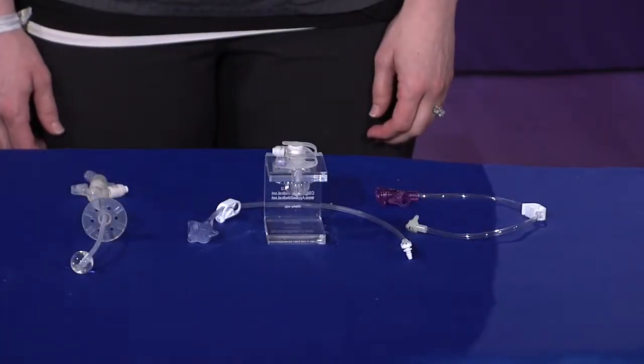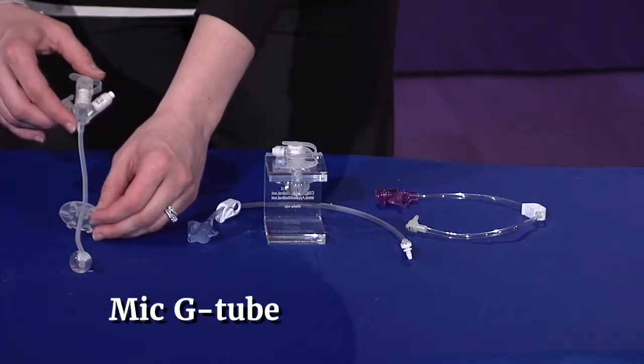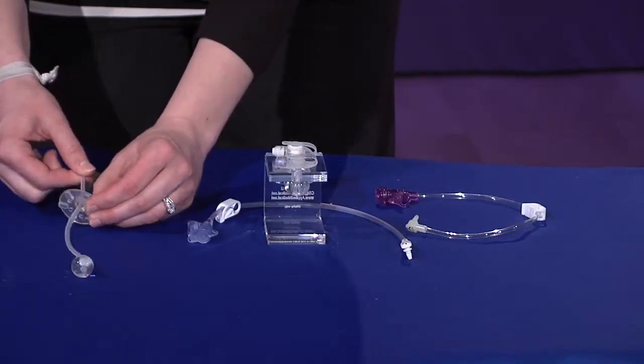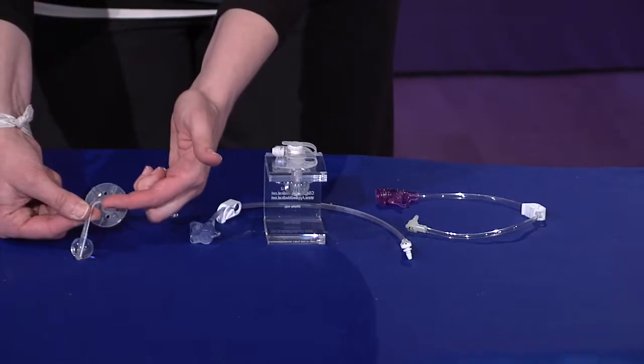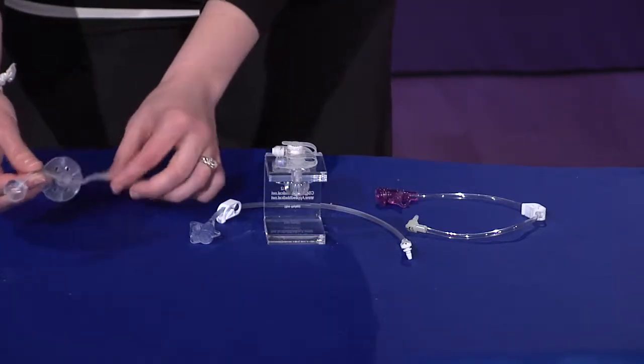The first tube is a MIC-G tube, which is a long tube with an internal balloon. There is a movable silicone bolster that should be tightened to the abdomen to help hold the tube in place. There are also markings along the tube to show the length measurements. There is not a clamp on this type of tube. You will learn how to kink or bend the tube over instead.